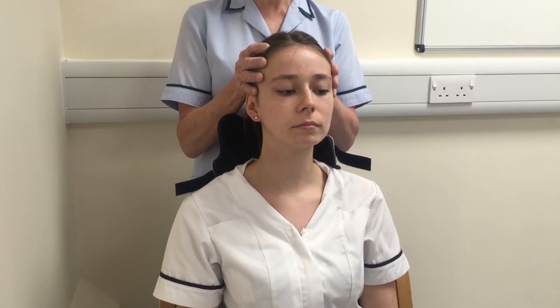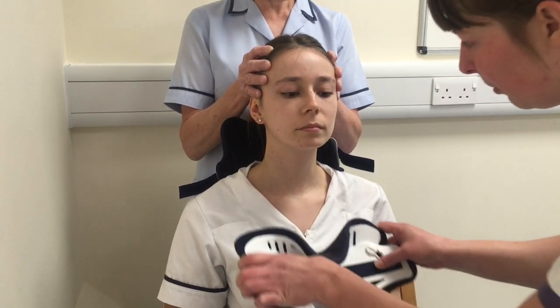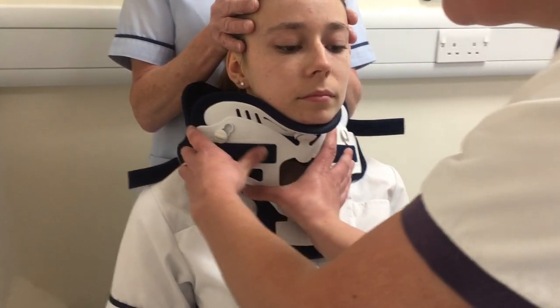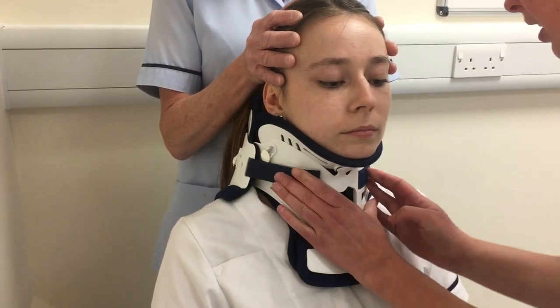Then we want to change the liner and reapply the collar. We're going to open it nice and wide, scoot it out, and tuck it round. To start with, you can just loosely apply.